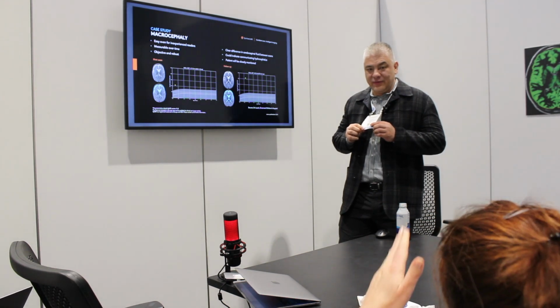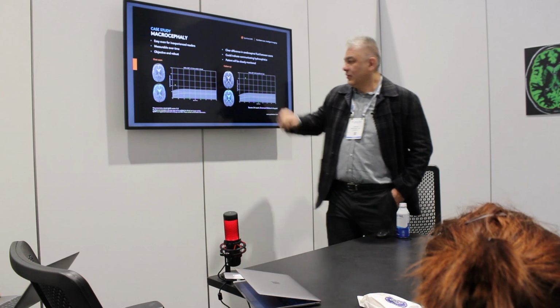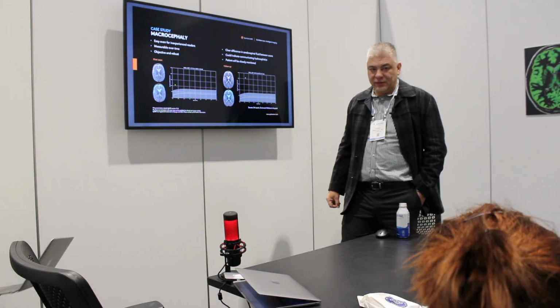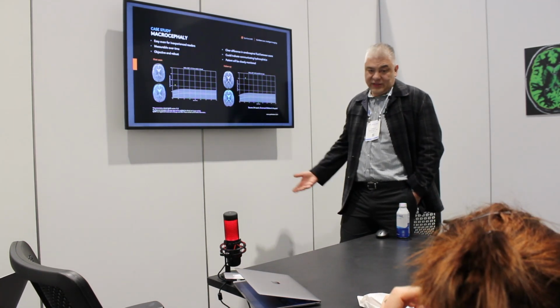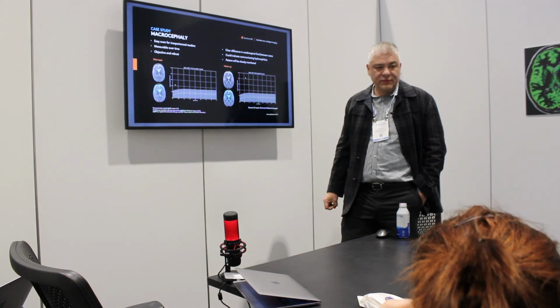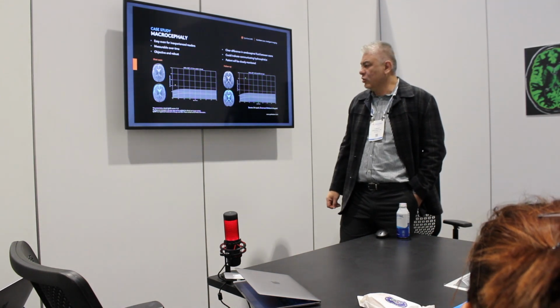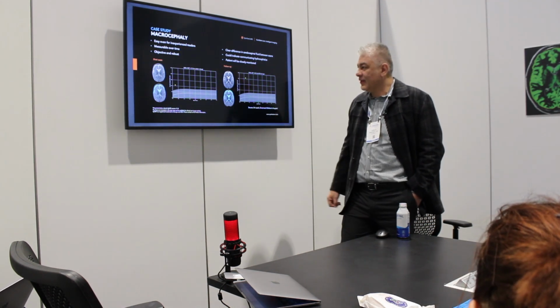So now you can tell, okay, there's a steep increase, and so possibly you'll have to make consequences, shunting. Exactly. So there's more of a standardized reporting for the neuroradiologist versus objective. It was more objective. Next.